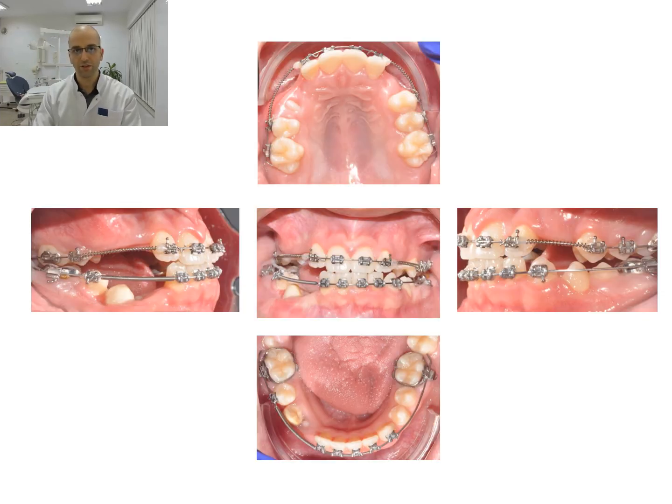After the lower right 5 was brought into position, that gave a chance for the first premolar to erupt spontaneously, and the canine could be noticed as well. My goal was to create enough room in the dental arches and facilitate the spontaneous eruption of the teeth. Basically, I was just trying to keep things simple.